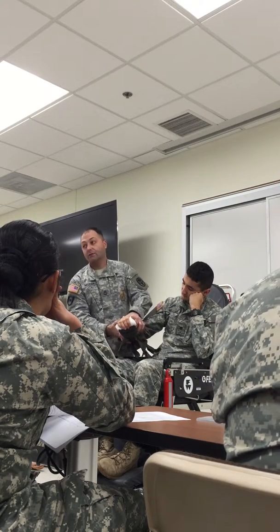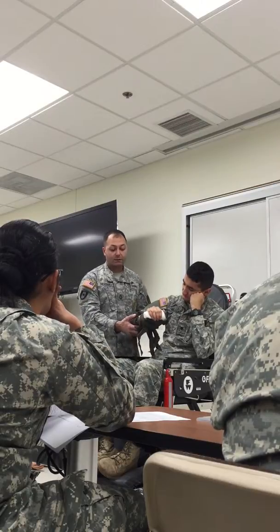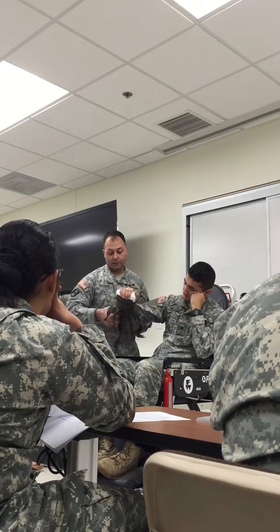All right, now my next one, check the pulse. Now the next one, check the pulse. Now the next one, check the pulse. Pulse is still present. All right, and there are four cravats on here.